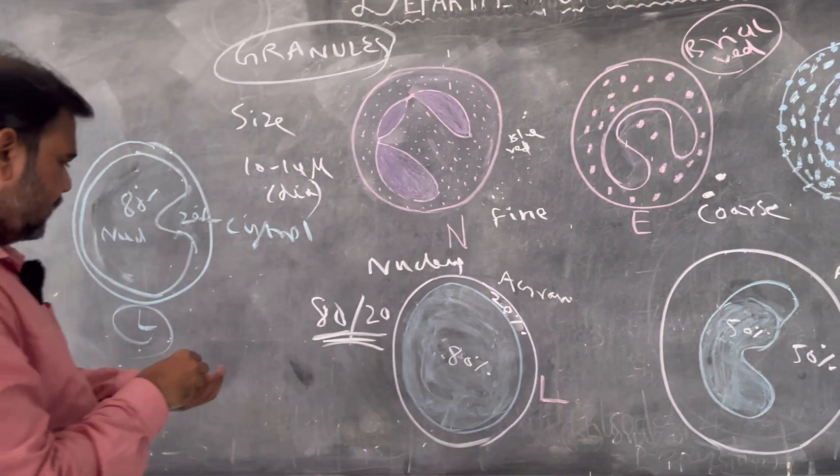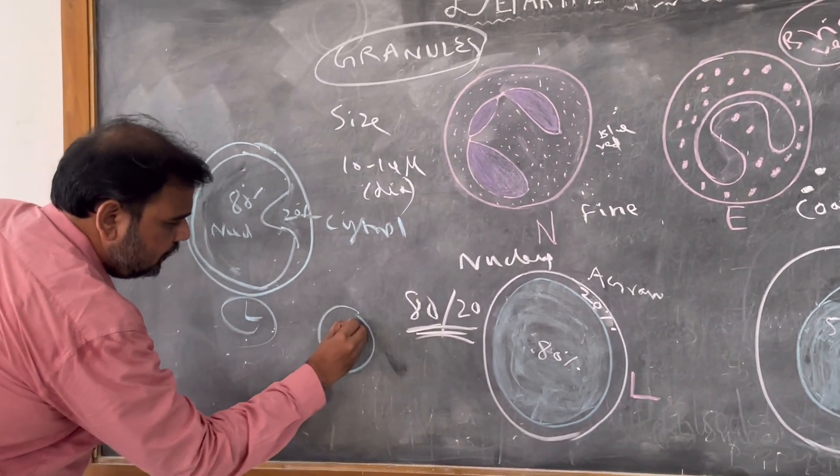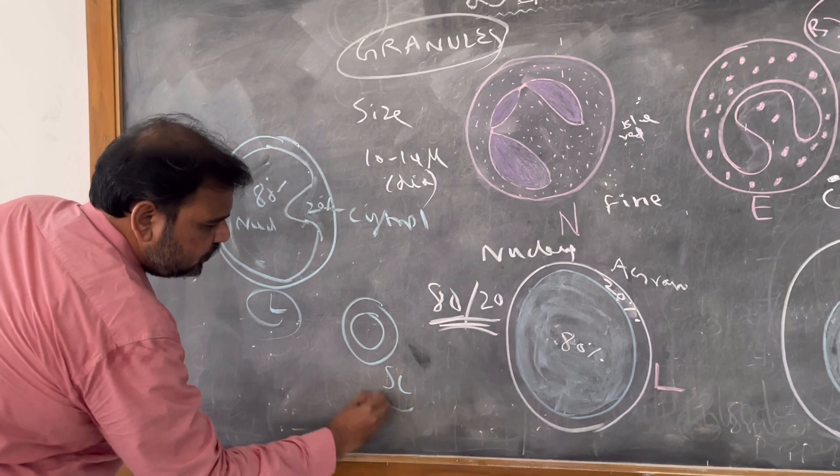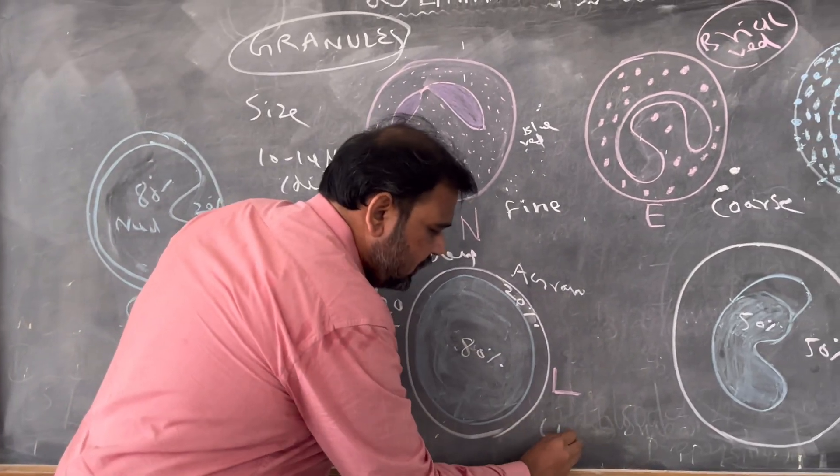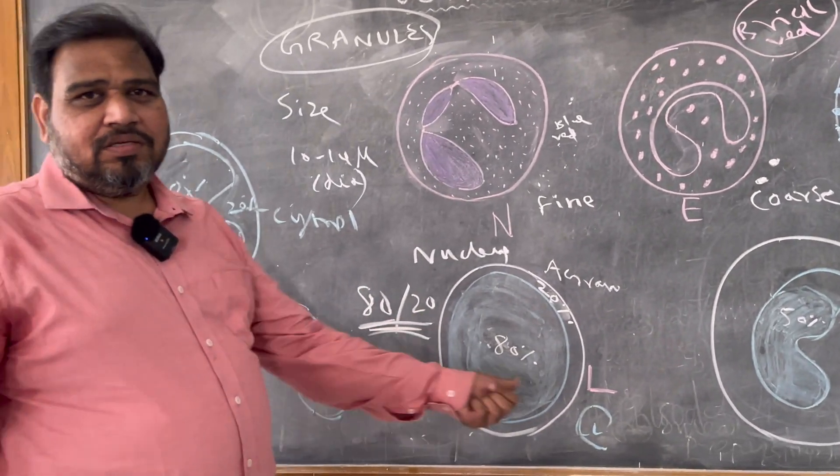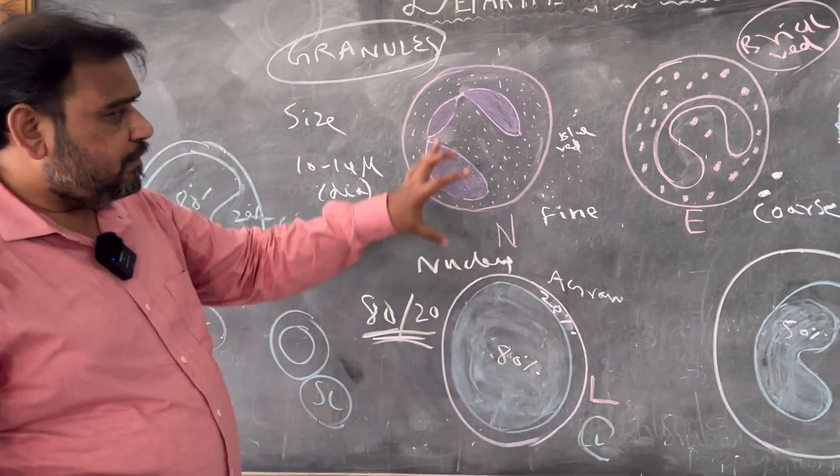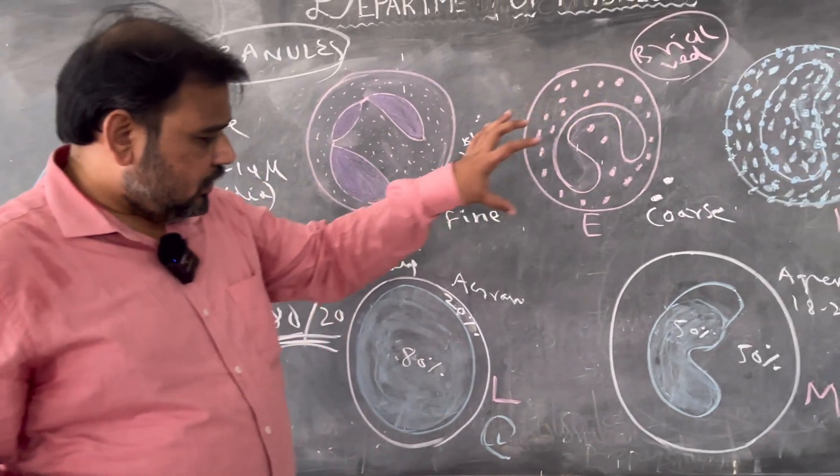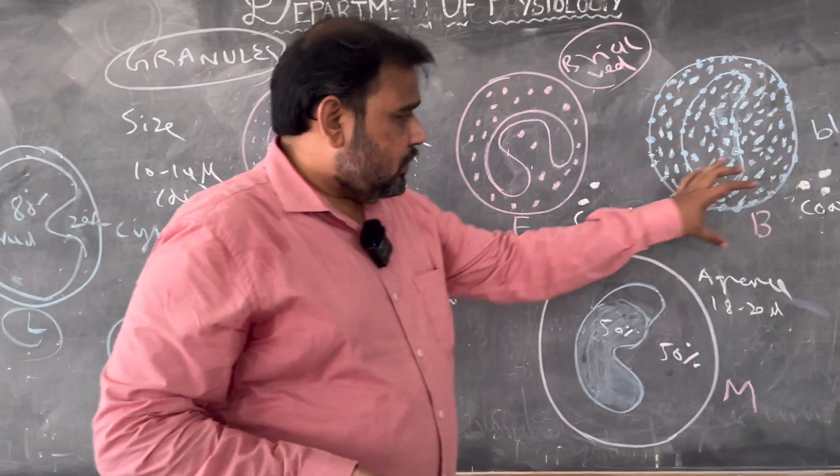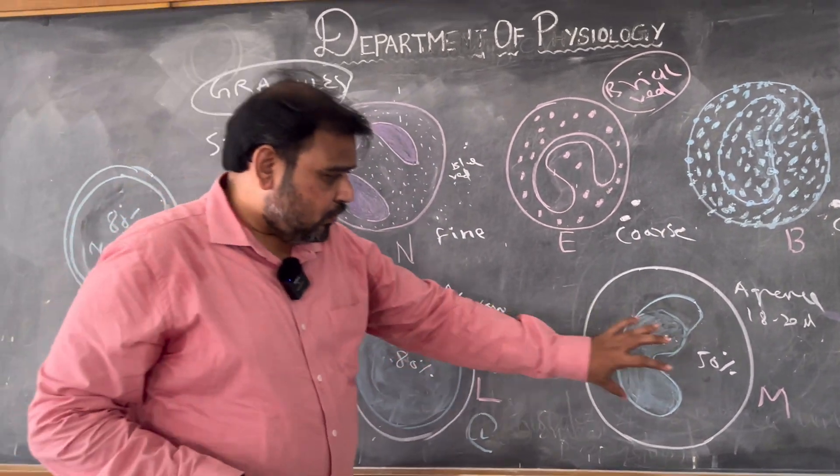If initially you are able to see very small like this, then you can tell small lymphocyte. This is large lymphocyte. I do not think small lymphocyte, large lymphocyte differentiation is needed. You just mention neutrophil, eosinophil, basophil, lymphocyte, monocyte.